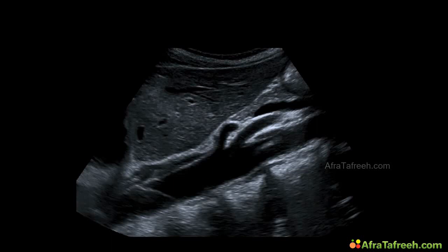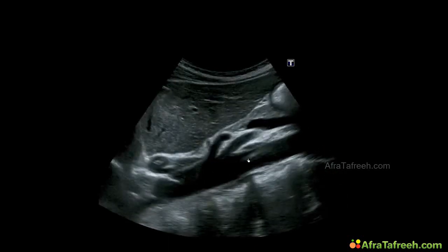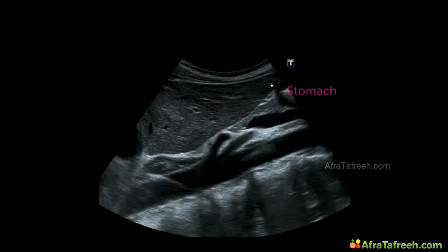Once we found the aorta, we can name the structures on the screen. We see the aorta over here, posterior to the aorta, the spine, anterior we see the left liver lobe in the near field, parts of the diaphragm, parts of the heart, and we can already detect 2 branches of the aorta directing towards the abdominal wall of the patient. So let's go for the video clip, and we can nicely see the pulsation of this great vessel. There's the stomach over here, also over here, the cardia of the stomach, and in this area we can see the pancreas.